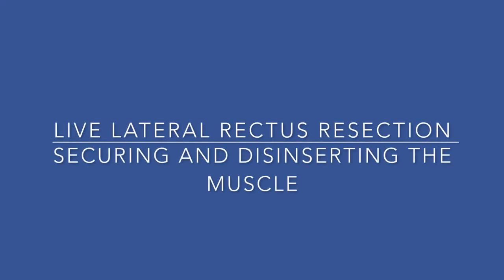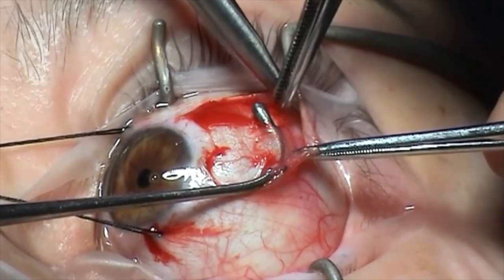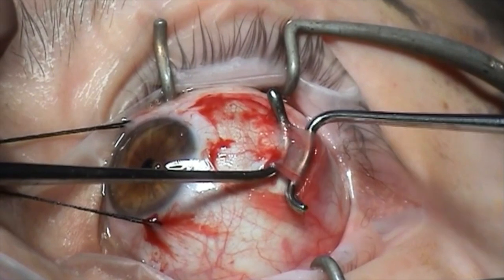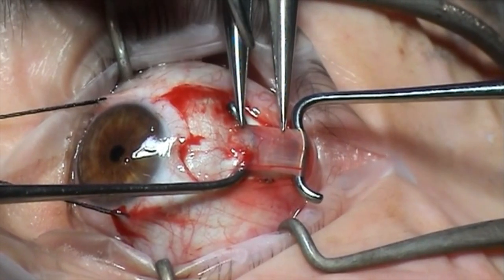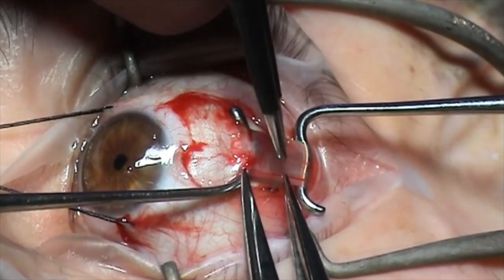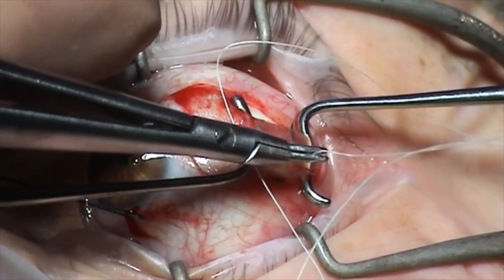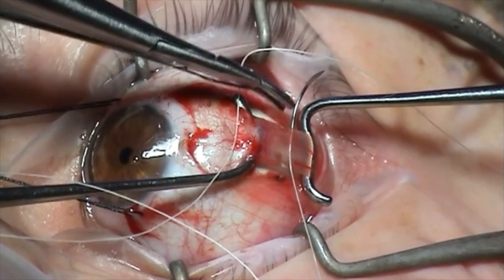This is a live surgical clip of a left lateral rectus resection. Having hooked the muscle and cleaned the Tenon's capsule from the lateral rectus tendon, placing a Chavasse squint hook to spread the muscle. We're marking five millimetres posterior from the insertion with some gentle cautery, and then using interrupted 6-0 Vicryl. Here the first pass is made through the upper third of the muscle, coming out through the edge of the muscle with the first pass.